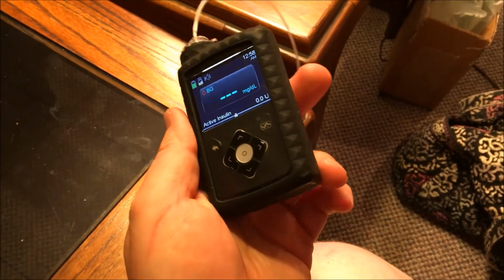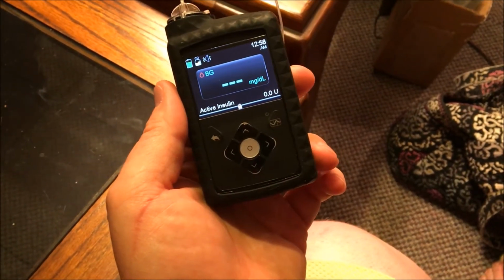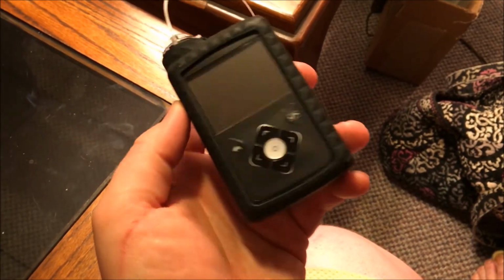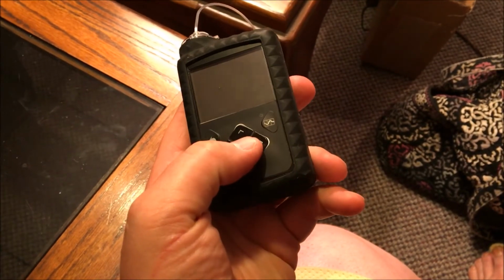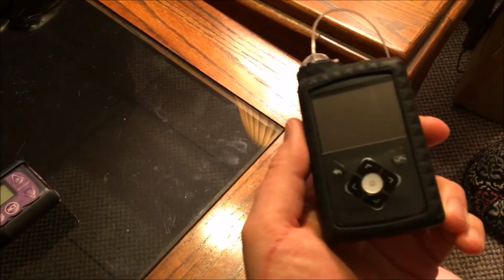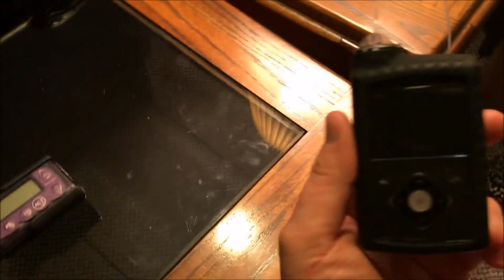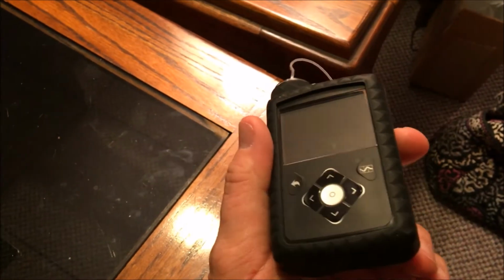But I also really like that I could bolus at a faster speed if I want. I don't have to stick with the slow bolus. Now I can feel it go through my arm or my stomach, wherever I have it, a lot quicker, but that is a pretty awesome feature. It is pretty easy to navigate with these buttons, just as it was with the buttons on the other one here. It's hard for me to tell you one's better than the other. Obviously it's bigger on that one, but you get the bigger screen here. So I think that takes precedence, and I think that's a victory.